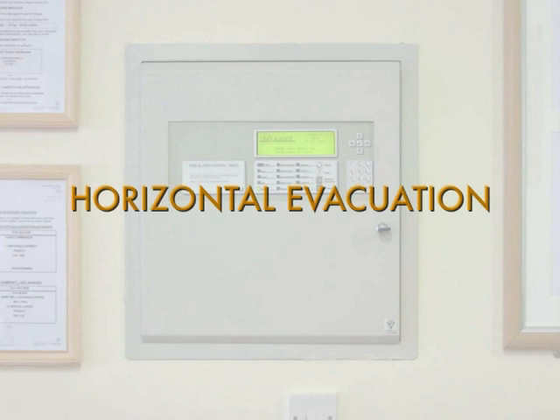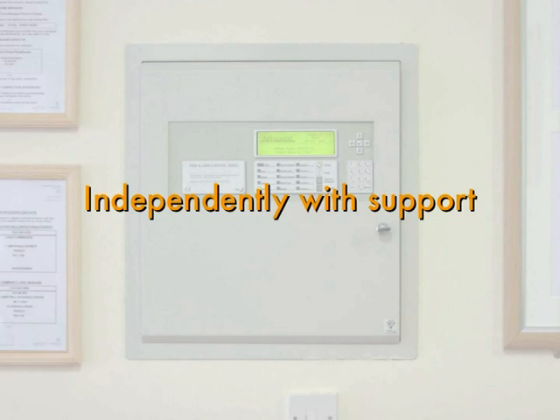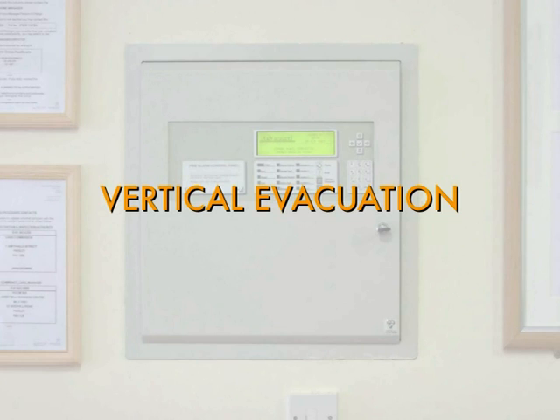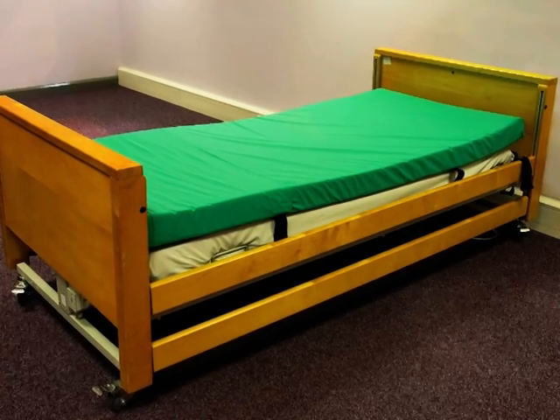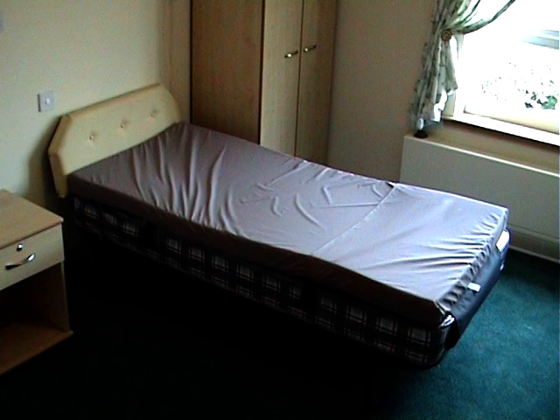For horizontal evacuation, the service user should be able to be assisted using a wheelchair or to be assisted to mobilise independently with support and reassurance from care staff. For vertical evacuation, the amber light service user needs assistance by care staff to go down the stairs. If not able, a ski sled should be used to aid vertical evacuation. The equipment recommended for these medium-risk service users are, for the profiler bed, a green evacuation sledge, ProPad. For the divan and hospital bed, a pinky grey evacuation sledge, ProPad.